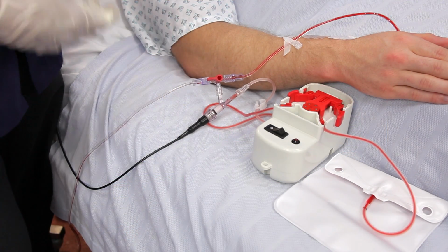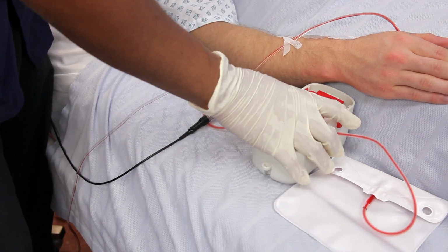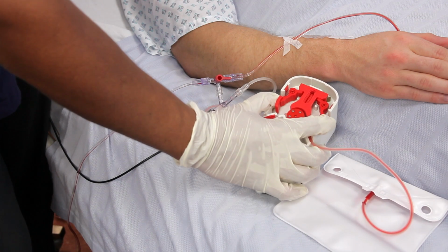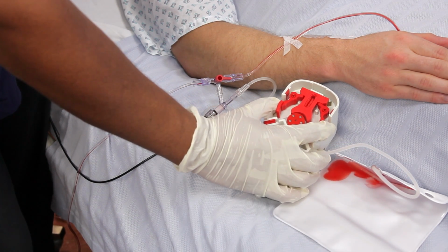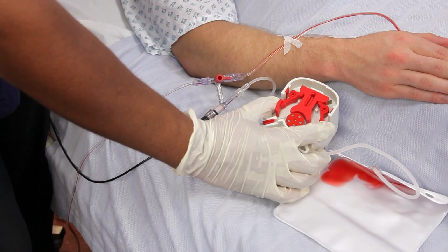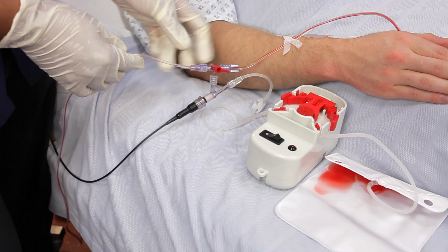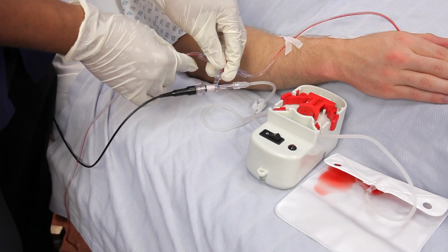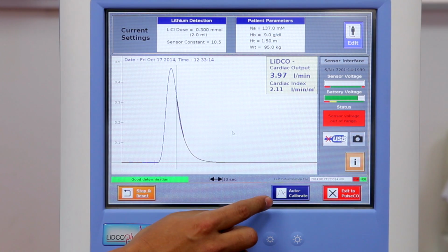Remember, to flush the arterial line, just open the sensor to the transducer and flush it with saline. Ensure you squeeze the tension levers on the flow regulator to allow the flow of saline into the blood collection bag. Make sure you flush the arterial line and re-establish the arterial waveform. Calibrate the LiDCO Plus with the data obtained by pressing Auto Calibration.